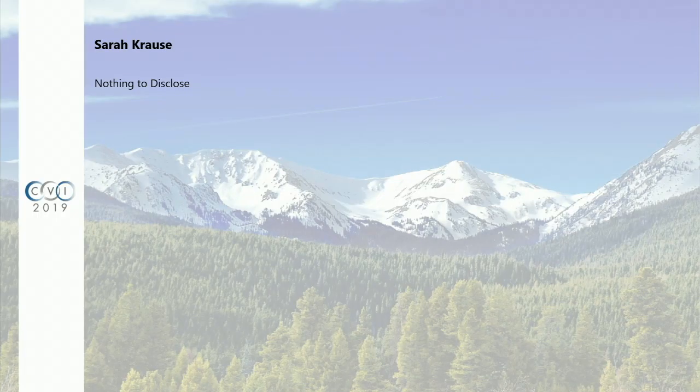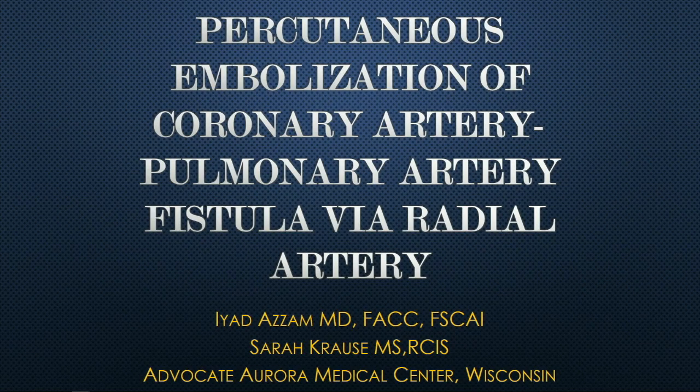I am a cath lab tech. I'm Sarah Krause. I work at Advocate Aurora Health in Wisconsin. I'm going to be presenting a percutaneous embolization of a coronary artery to pulmonary artery fistula via the radial artery.